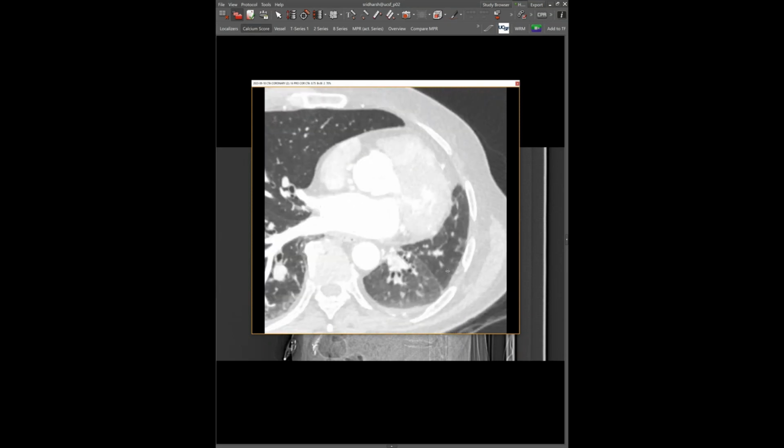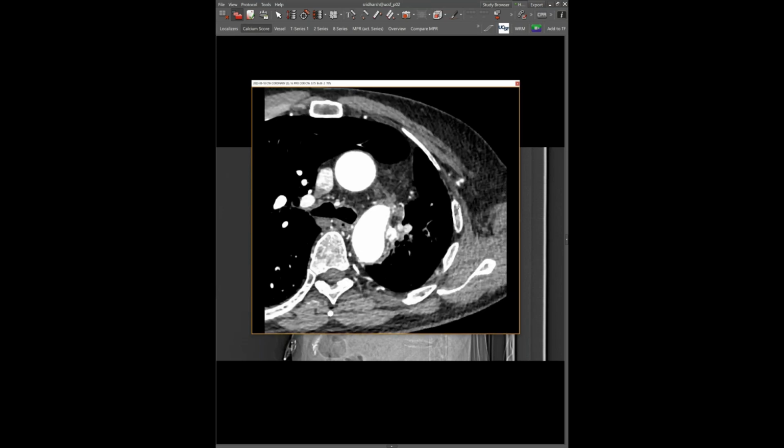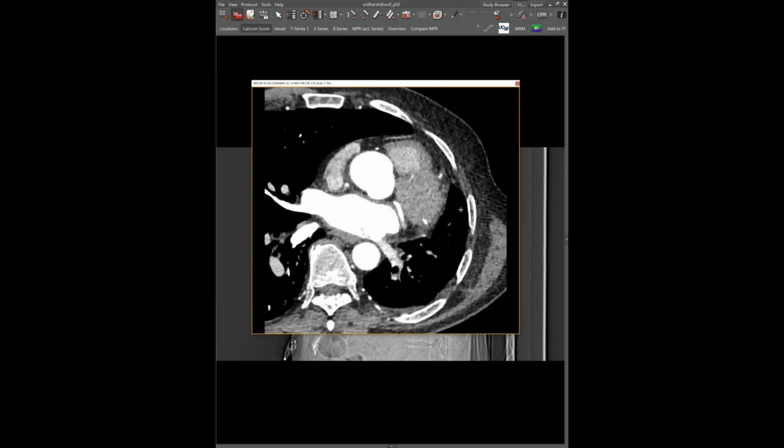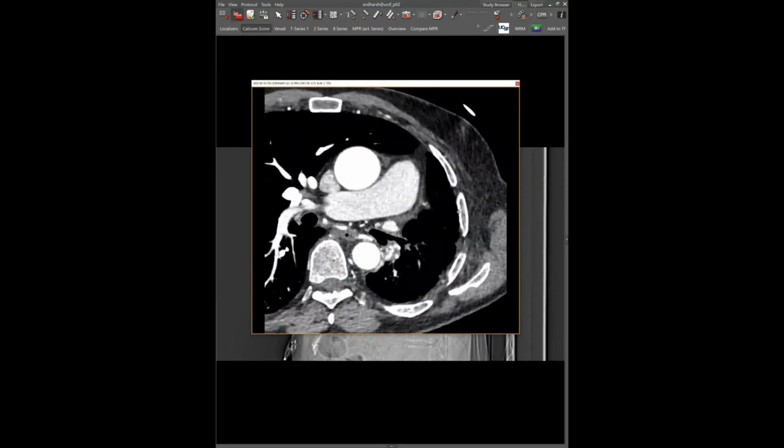Yeah, interesting. We've seen cases of, typically, of course, we talk about bronchial artery supply with proximal interruption, but we've shown cases like this where the arteries involved come from the coronary arteries, other vessels, upper abdomen. I'm not sure if I've seen one of those, but I have seen, like your case, vessels coming off coronary arteries and going to the affected lung. I don't know if I've ever seen a case in which there is thought to be an actual steal phenomenon sufficient to produce symptoms.